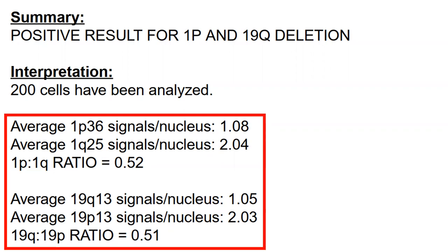And maybe the cutoff in the particular laboratory, because it's paraffin sections cut and all that, is 0.75. So it qualifies technically for being a deletion. But that varying ratio, you should not see that. The two ratios should be close together. It doesn't have to be 0.5. This is a beautiful, perfect result. It could be 0.61, 0.63, et cetera, but they're very close together. Everyone understand that? That's just a little trick, if you will, for spotting false positives when you didn't expect it.